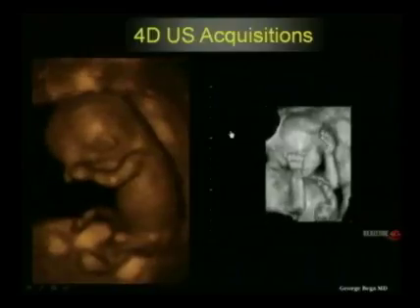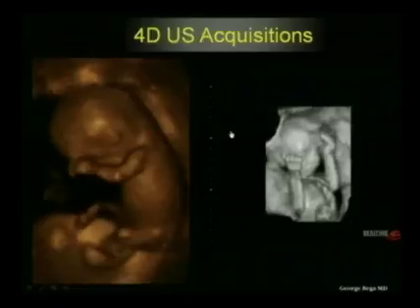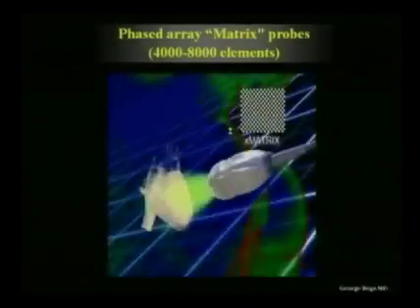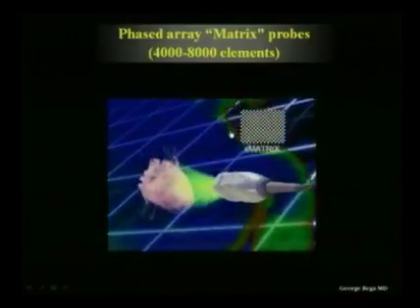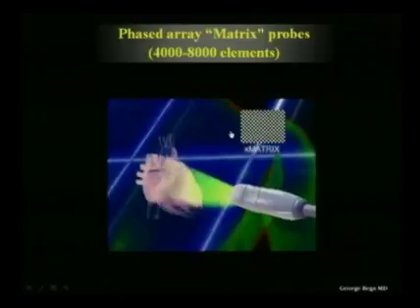Again, the volume acquisition angle will impact the volume acquisition rate. Typically, the wider the angle, the slower the acquisition. The newest and most advanced acquisition mode is the matrix acquisition. This is the future of 3D ultrasound.